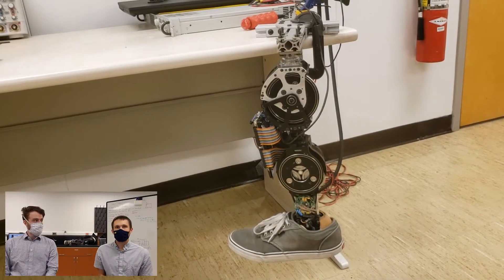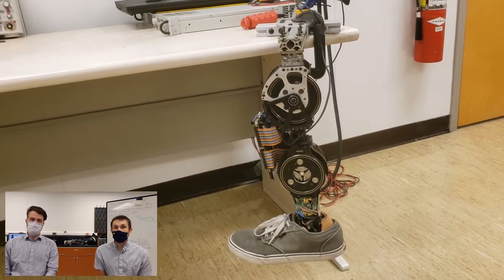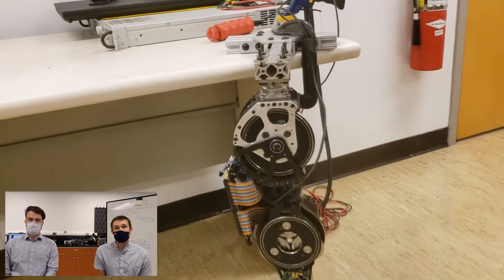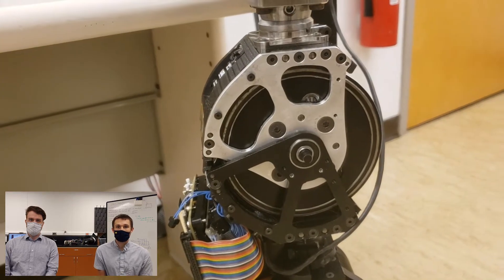Hi, this is Chris and Kevin with the Locomotor Control Systems Laboratory at the University of Michigan. Today, we're here to talk to you about some of the features and technological advancements of our lab's second-generation knee-ankle powered prosthesis.